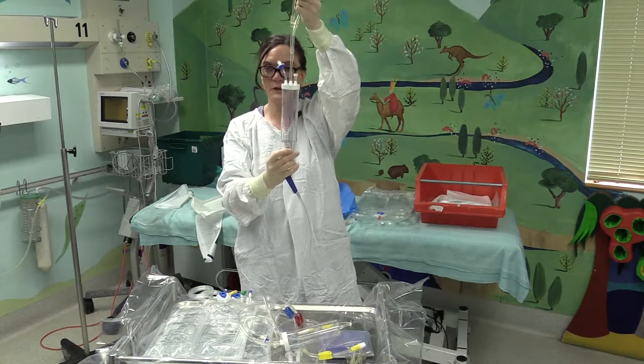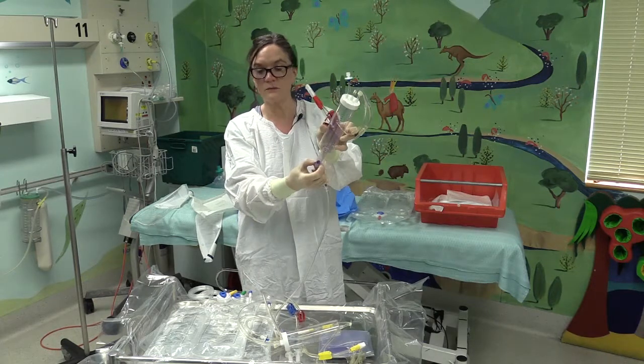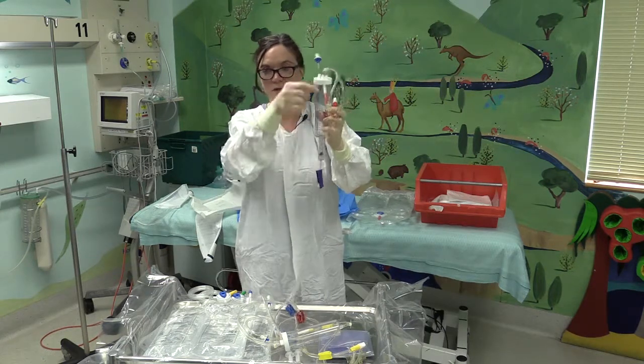So that's the fill chamber. It's measured in increments up to 250 mils, and it has a little ball there which will stop the solution to prevent air going into patients if this becomes empty.